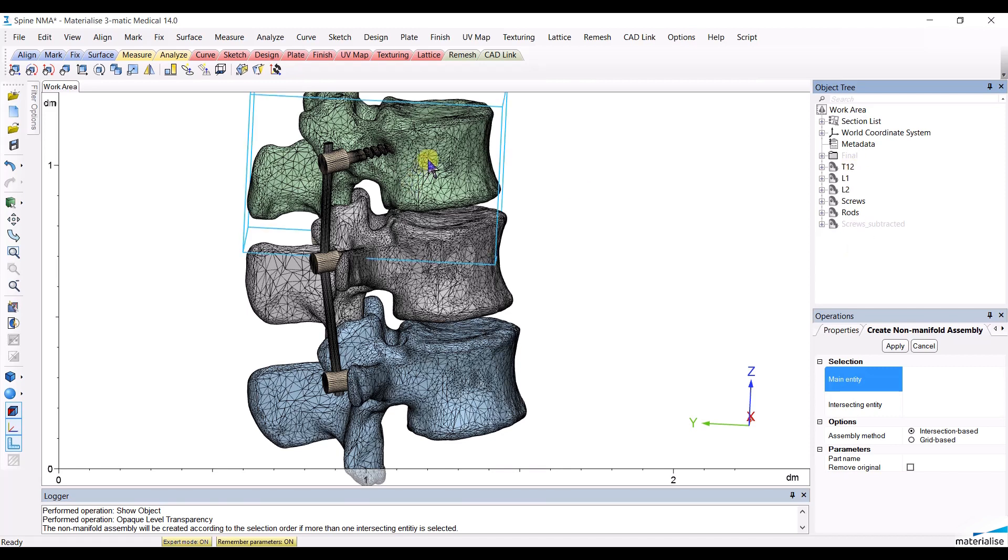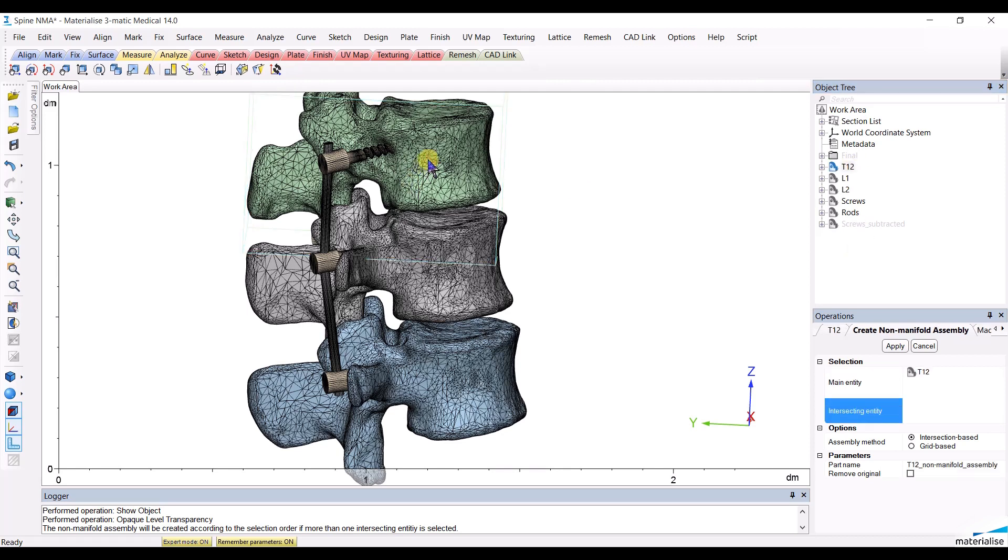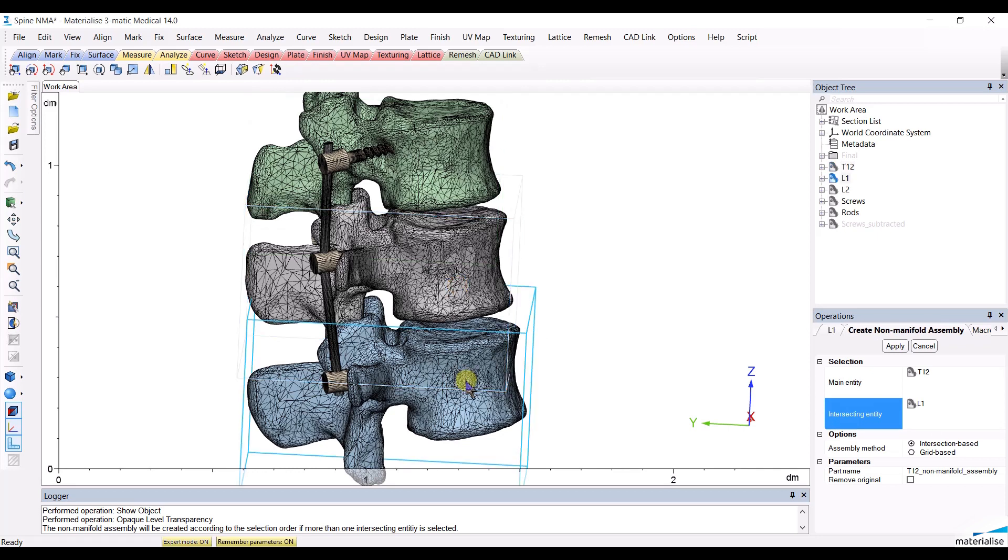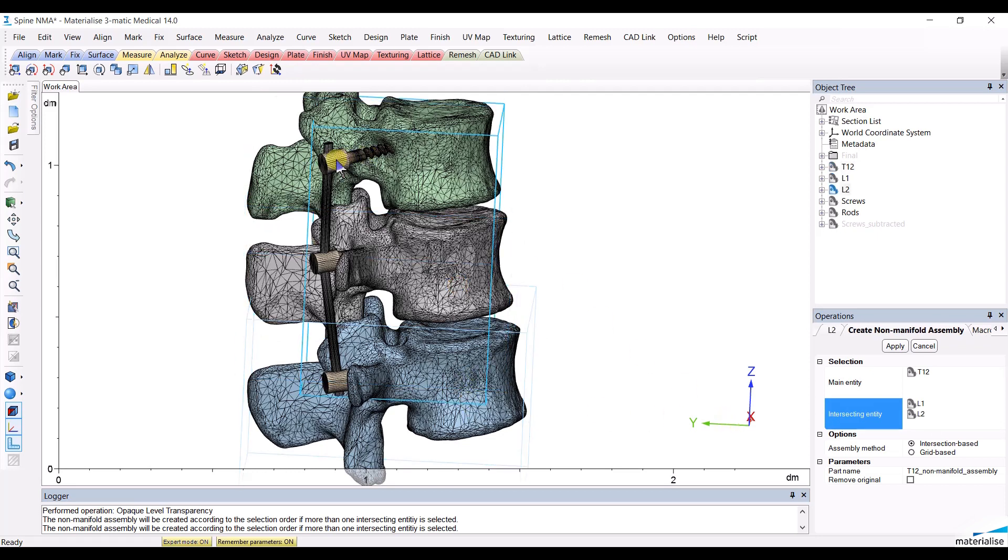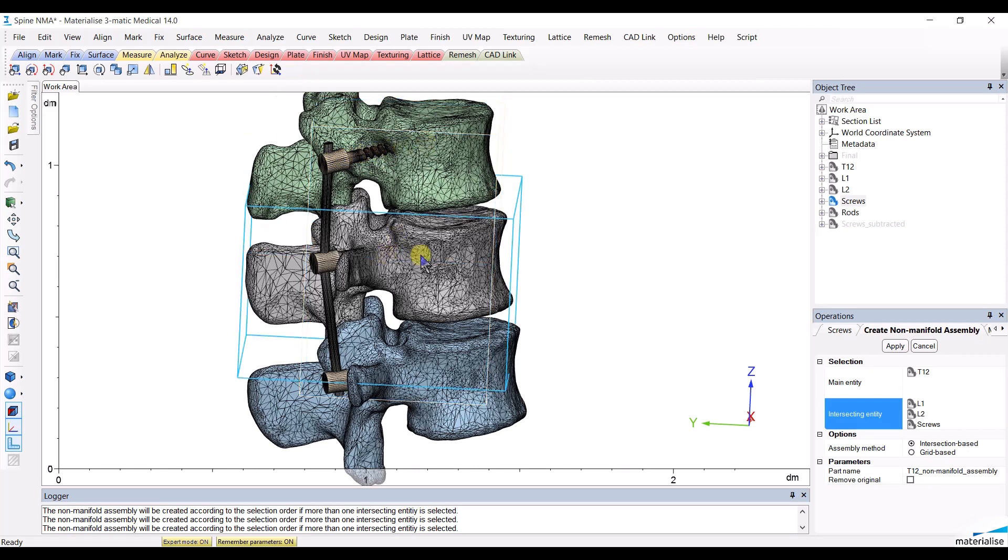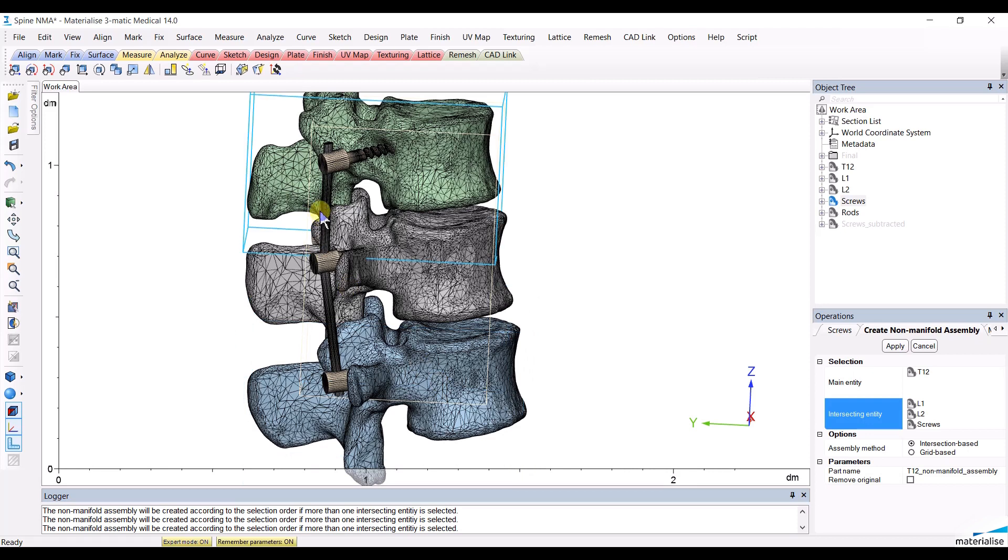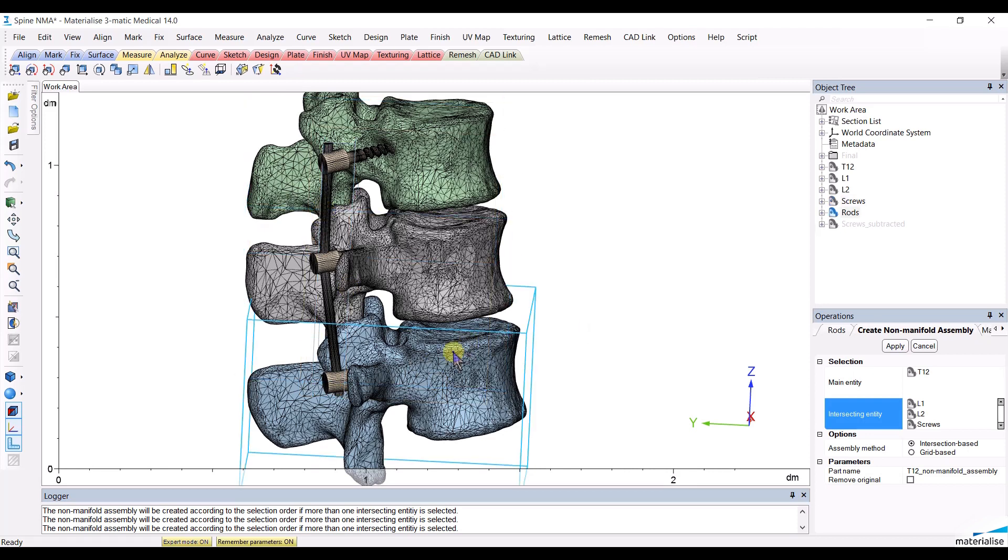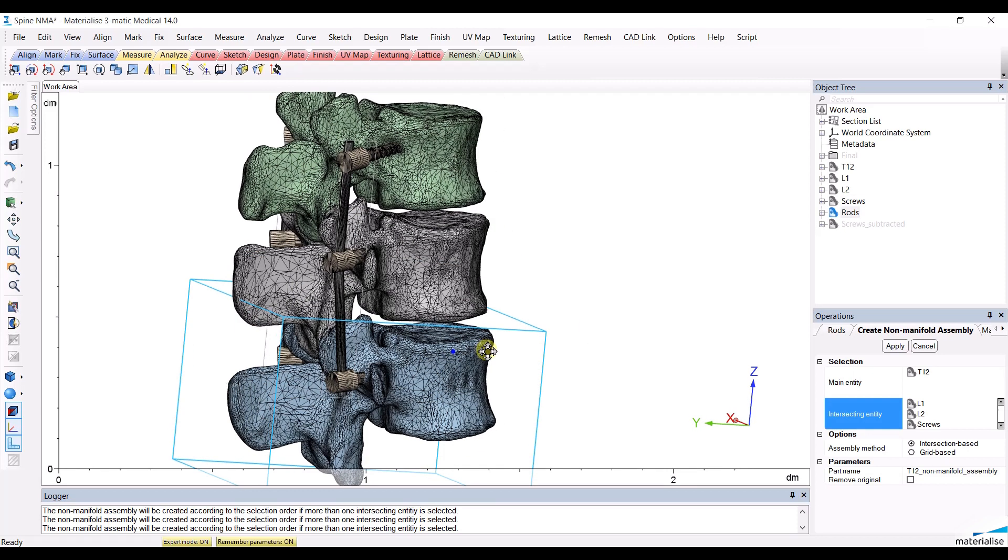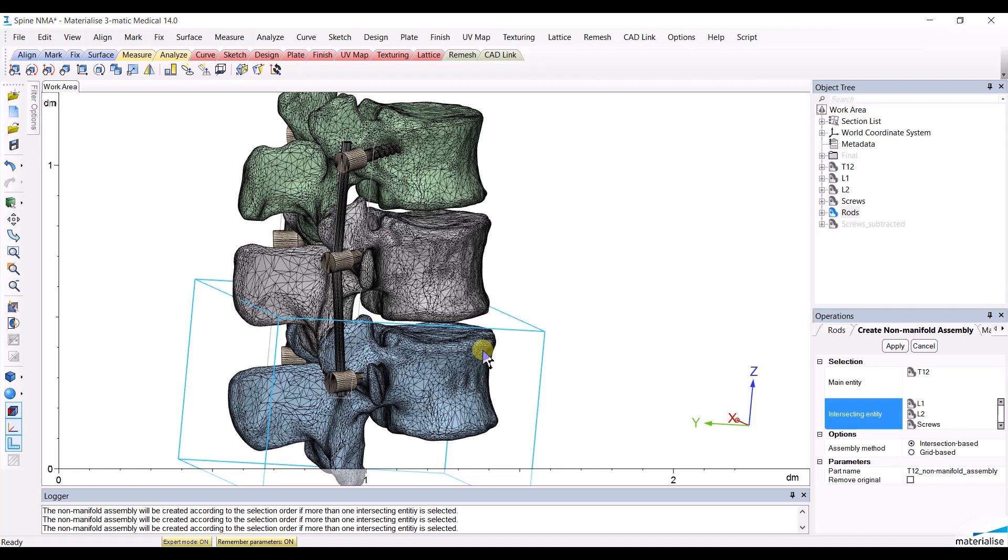Let's start with the top vertebrae, that will be the main entity, then select the second vertebrae and the third vertebrae. Let's then select the screws that do intersect with each one of the vertebrae and that will be subtracted from them. And then finally let's select the rods that are intersecting with the screws and hence will be subtracted from them.